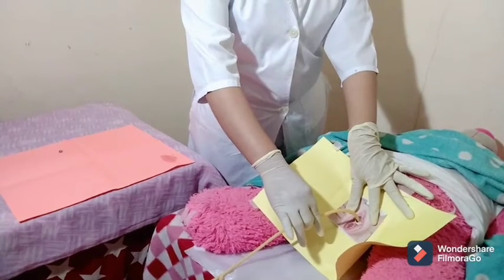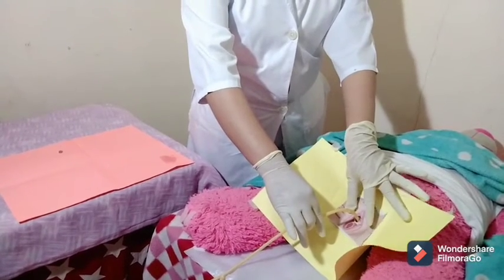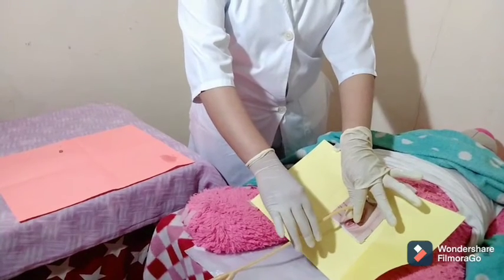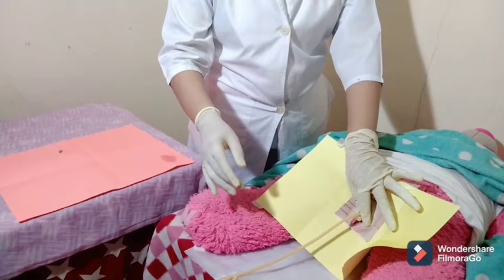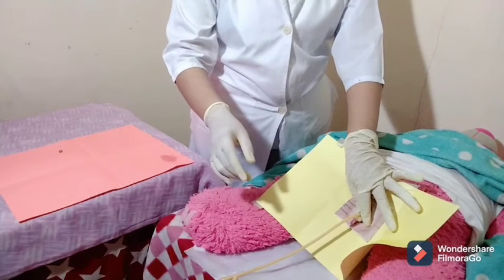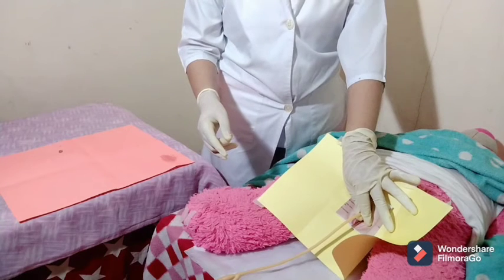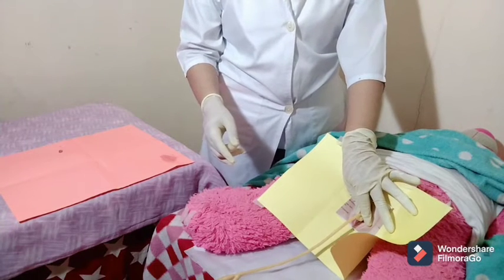Hold the catheter securely with your non-dominant hand while the bladder empties. Collect the specimen if required. Continue the drainage according to hospital policy. Remove the catheter smoothly and slowly if a straight catheter is used. The catheter is only needed to drain urine present in the bladder and is not intended for continuous use.